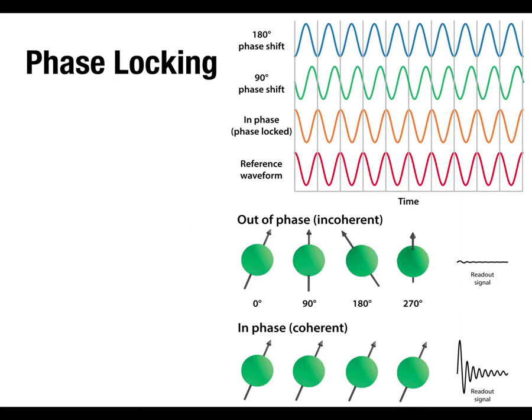Okay. So when these protons are just sitting there and you're lying in the scanner, nothing else is going on, they're all precessing, but they're all precessing at slightly different rates because of other factors, like the fact that they don't all align perfectly with the magnetic field. There's other factors influencing things. So their precessions are all going at more or less the same rate, but they're not in phase with each other. So as one's here, another one's here, and they're going like that.